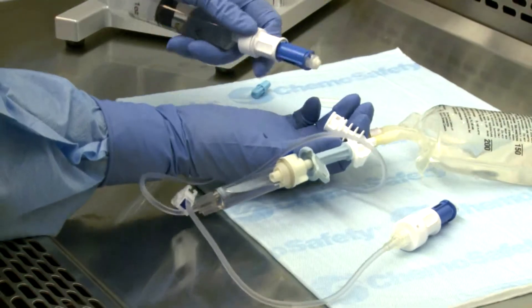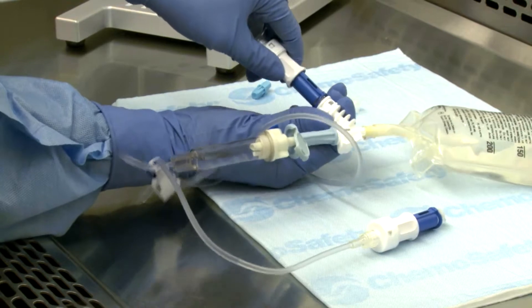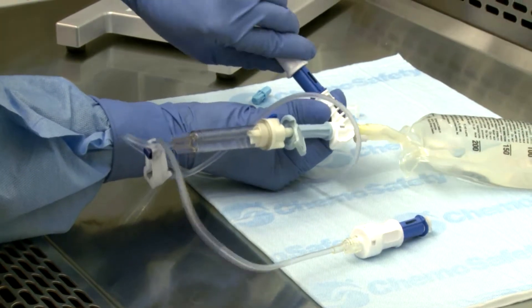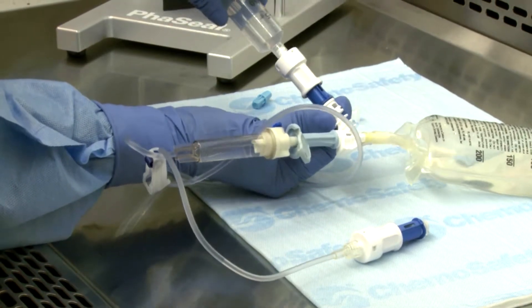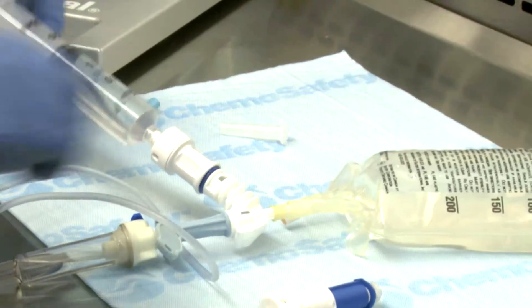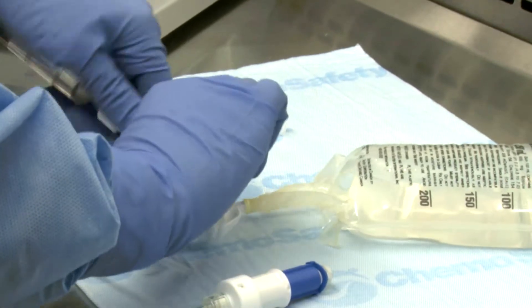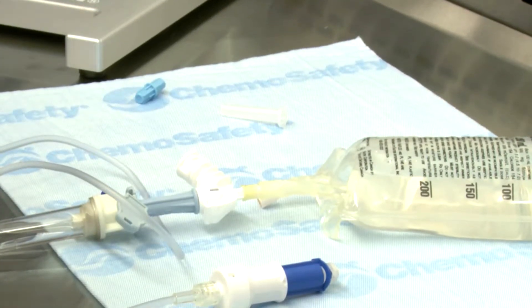Next, engage the prepared BD-Facile syringe unit to the connection interface on the infusion adapter using the push-turn-push technique, and push the drug into the IV bag. Finally, disengage the syringe unit from the infusion adapter using the pull-turn-pull technique. Repeat the steps if additional syringe units are required. The IV bag is now ready for administration.